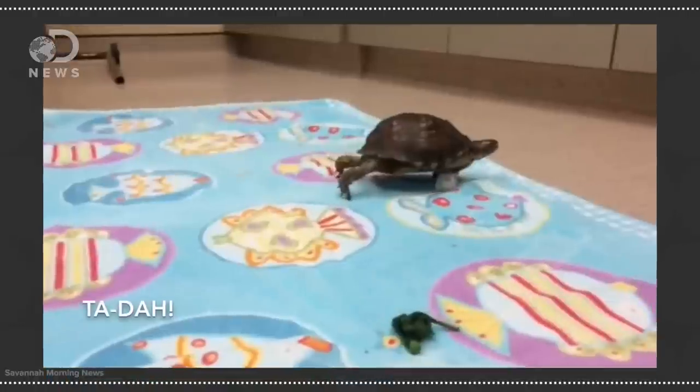...the students designed a ball caster-like leg that attaches to her shell, a design which can help her easily move in any direction. Using the school's 3D printer and a little help from their teacher, they helped Stumpy not be so stumpy anymore. Maybe she should be called Rolly.